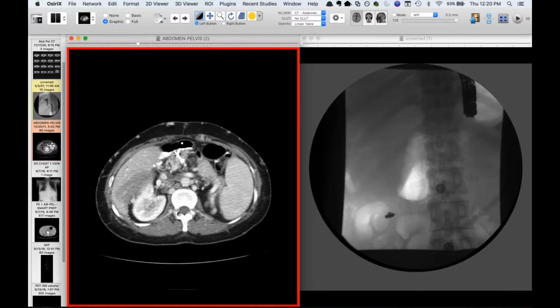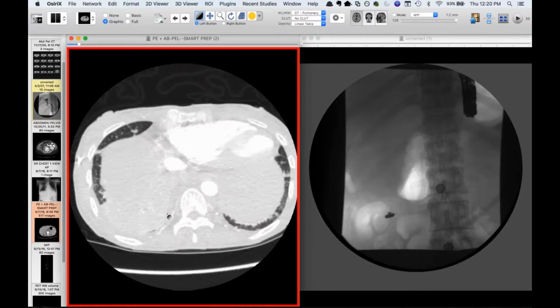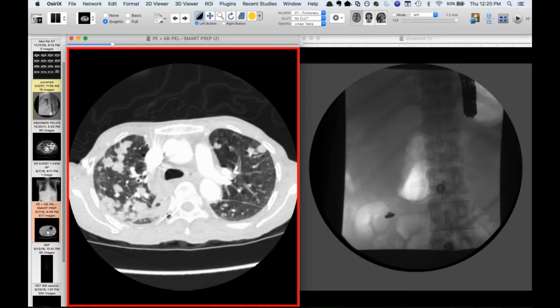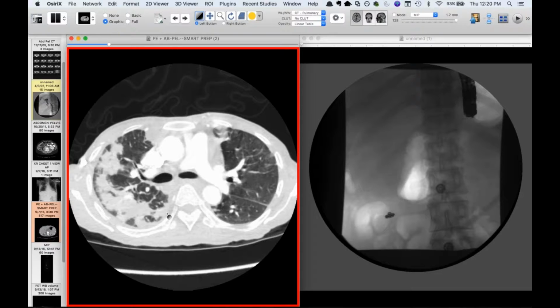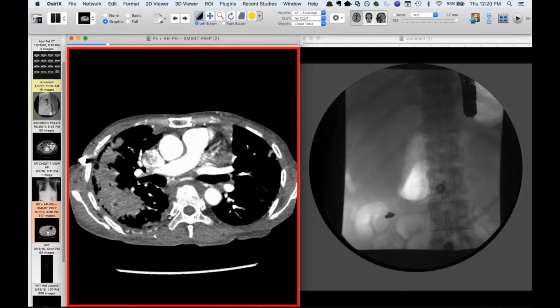But yeah, this one totally got me, because I had been given a history of cancer and didn't have a reason not to believe that. So, Travis, you've got all this stuff in her mediastinum. Do you think she's got IgG4 soft tissue in her mediastinum, and is it pinching off veins by any chance?